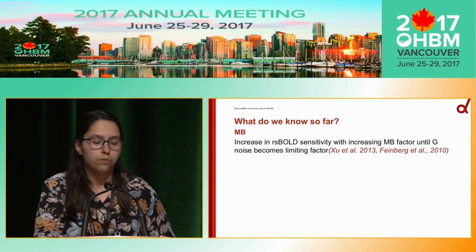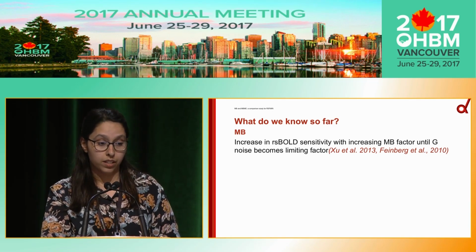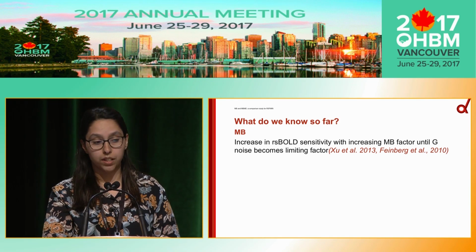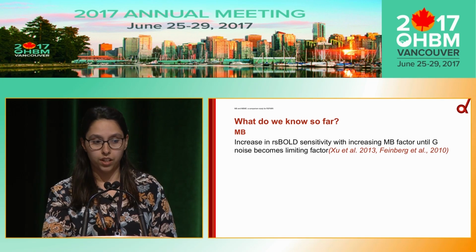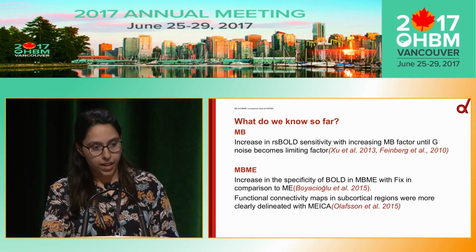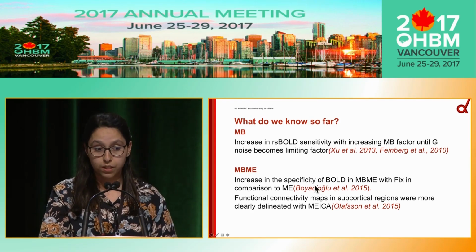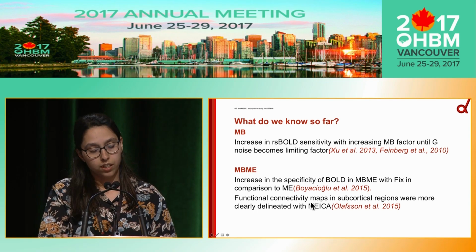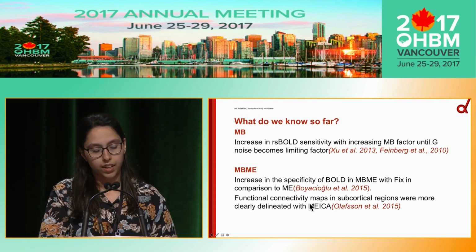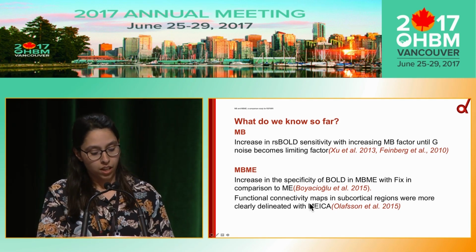So what do we know so far? From the literature, it has been seen that increasing the multiband factor will give you a high z-score value, until you reach the limiting factor of g-noise. You can increase the multiband acceleration factor and benefit from low TR and high volumes. Next, in multiband multi-echo, it has been shown in a study that it increases the specificity of BOLD, specifically in MBME with FIX in comparison to multi-echo, and this study was done on 7 Tesla data. The final study compared multiband multi-echo with multi-echo, and they found that multiband multi-echo performed superiorly in comparison to multi-echo for specificity.